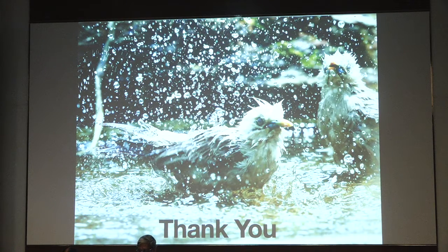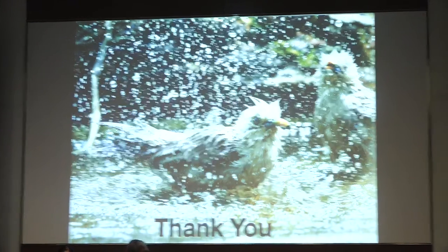So this was a nanophthalmic eye, and Hoffer-Q is the formula that works the best in my experience with such extreme cases. We had one more case, but because of paucity of time, I won't show that. But in long and short eyes, optical biometry is, I think, an essential tool besides immersion.